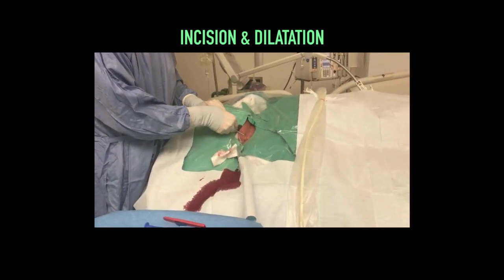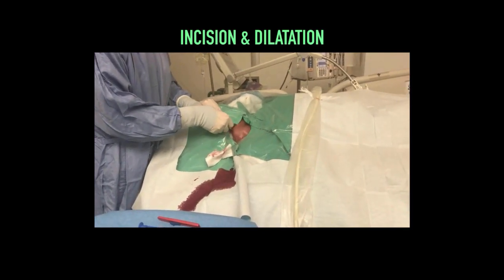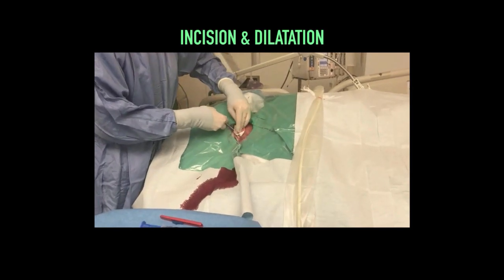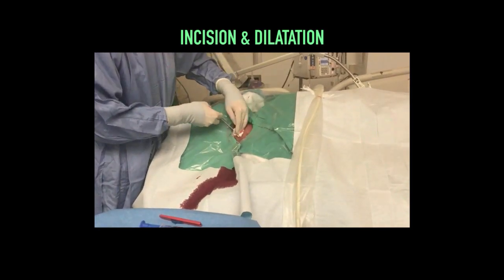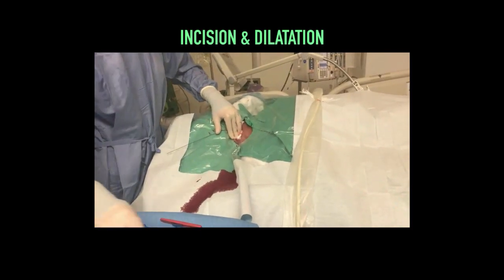As the introducer is pushed in, it is given a small turning motion to dilate the tract. The dilator does not need to be introduced along its entire length, only enough to establish a tract to the vessel itself. As the dilator is withdrawn, expect much bleeding. Therefore, compress the site as the dilator is removed.